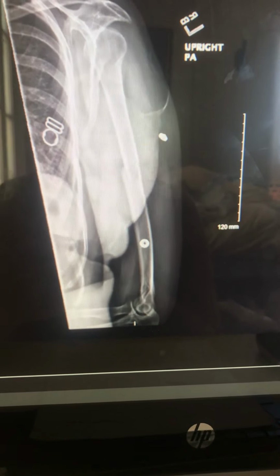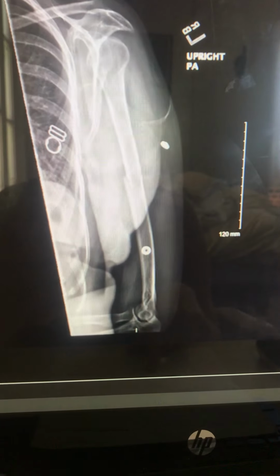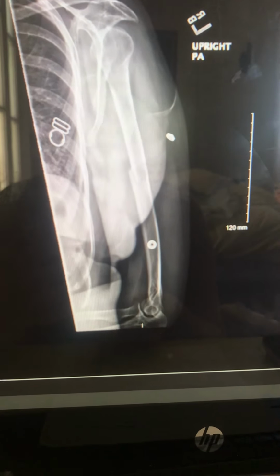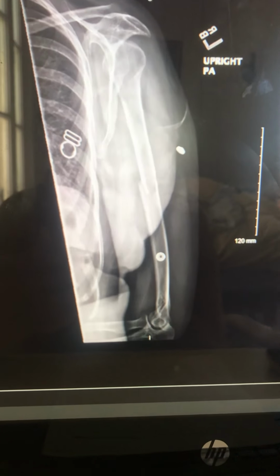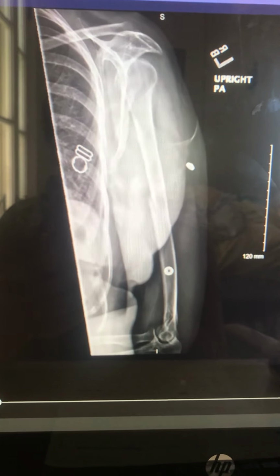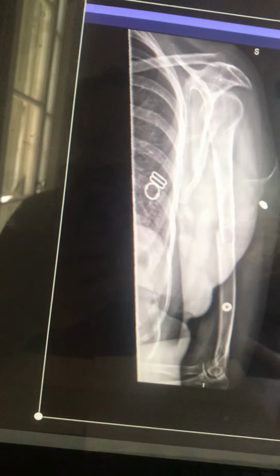The patient was upright and placed her humerus against the upright bucky. She had her arm placed across her stomach. That's how she was holding it pretty much the whole time. The arm was left in place for the PA medial lateral. She slightly leaned into the board to get the humerus as close to the IR as possible to reduce magnification.